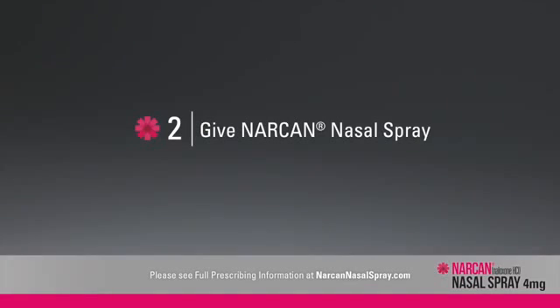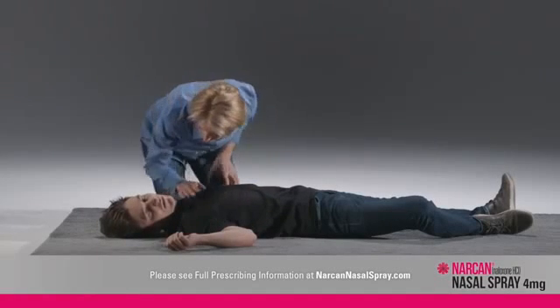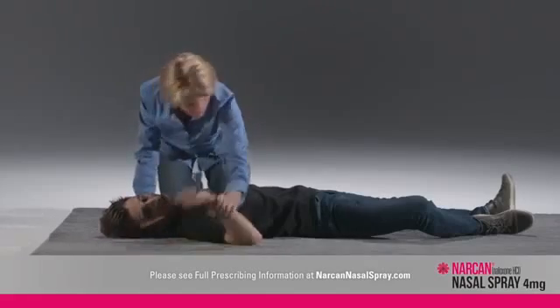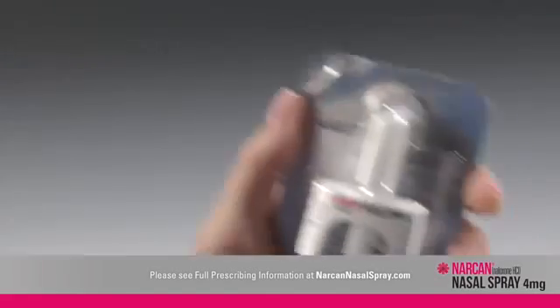Administer NARCAN nasal spray as quickly as possible if someone is unresponsive and an opioid overdose is suspected, even when in doubt, because prolonged respiratory depression may result in damage to the central nervous system or even death. Lay the person on their back to receive a dose of NARCAN nasal spray.